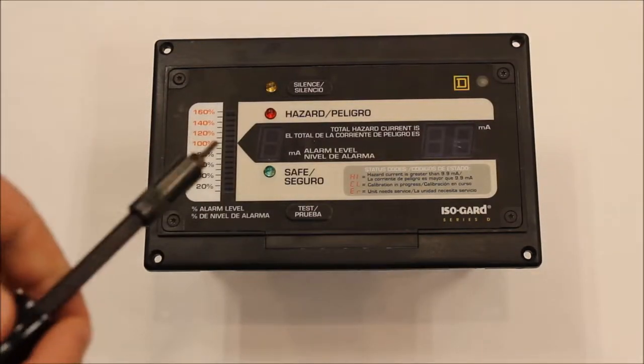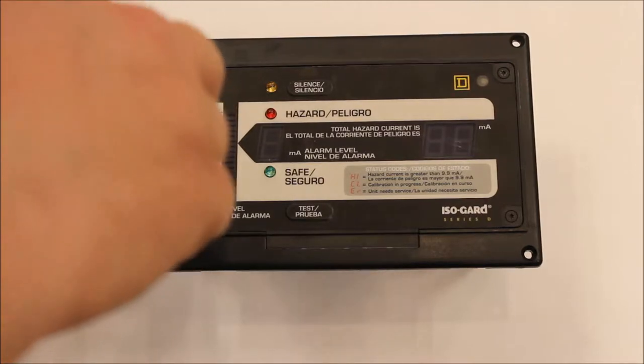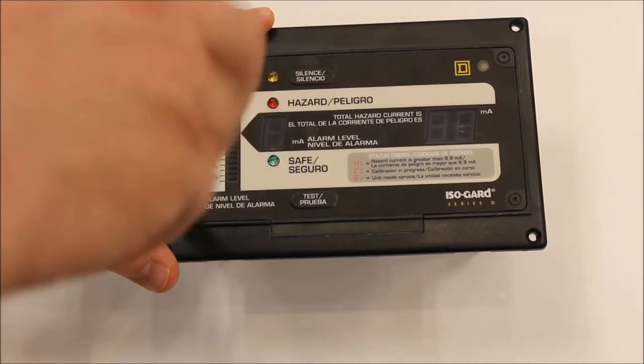This short video shows how to change the fuses of a Series D line isolation monitor. We're working on a bench here, but removing the limb from the panel is not necessary. Just be sure to follow all necessary safety practices in your work.